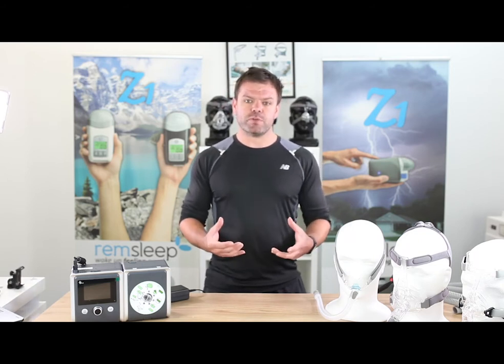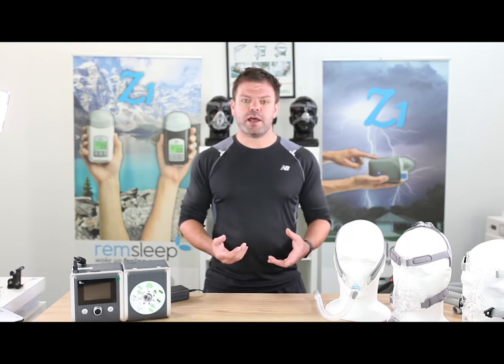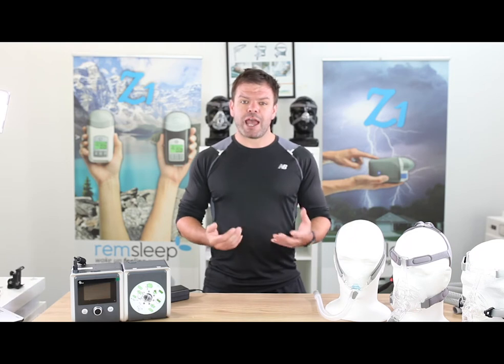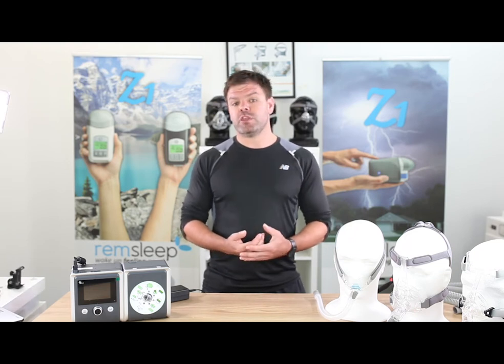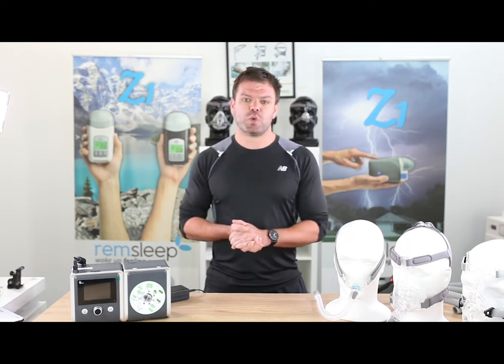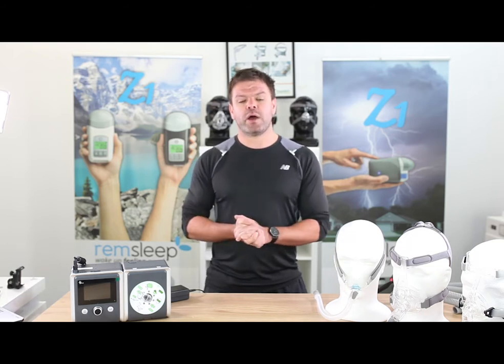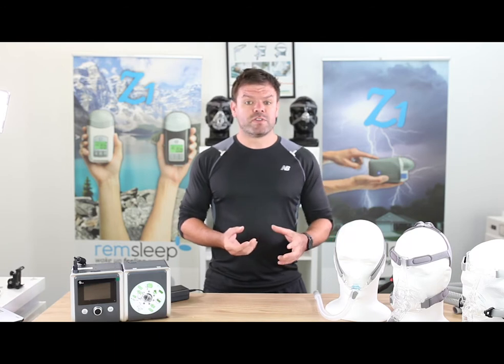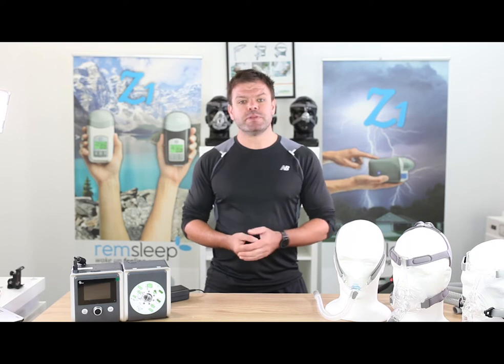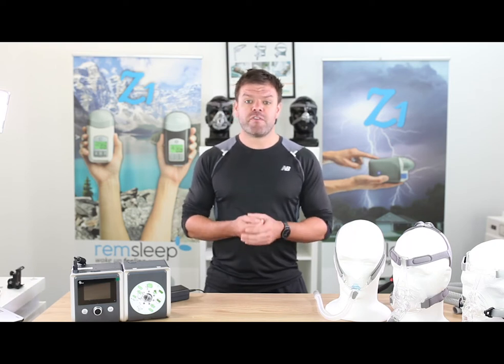So what are some of the variables and what do they mean? One is compliance, which is simply a measure of how much you're using the machine. You should be aiming for at least 4 hours per night with your machine, but ideally for the full night. For some, you'll take to it like a fish to water and sleep the full night from day one. For others, it may take a little bit of time to build up your compliance.